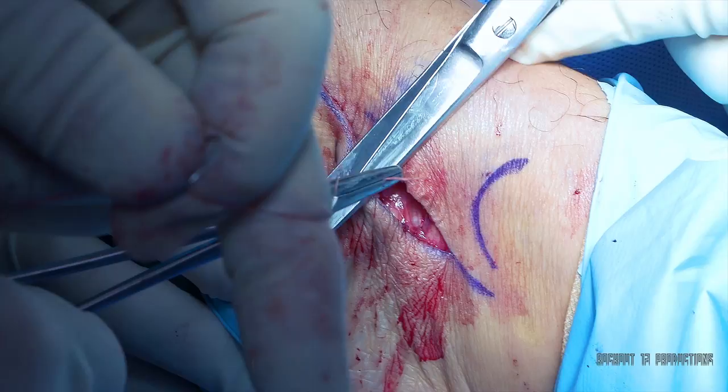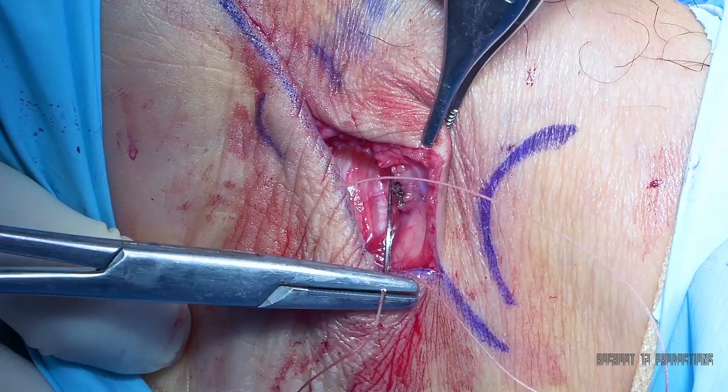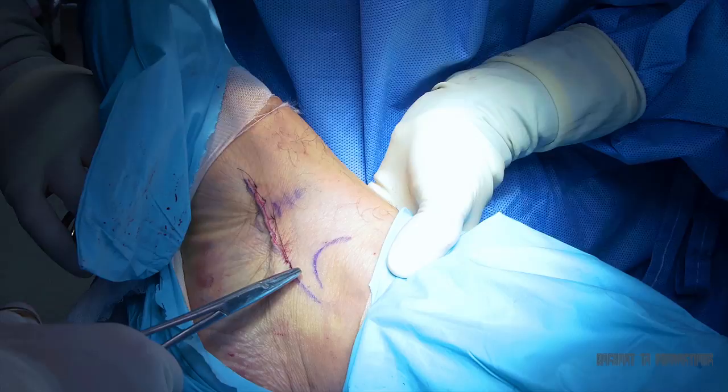Superficial fascia is closed with three O-Vicryl sutures. Skin is closed with interrupted nylon sutures.